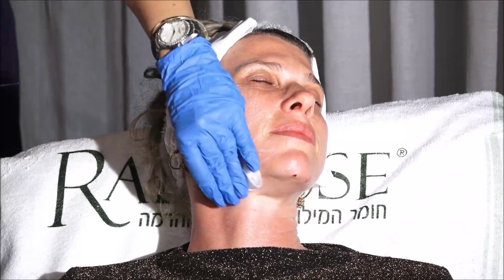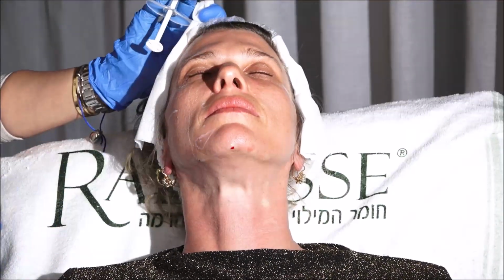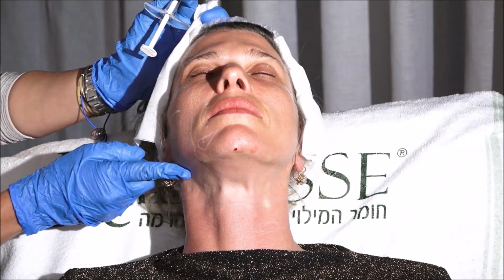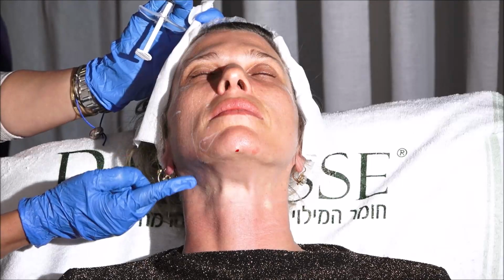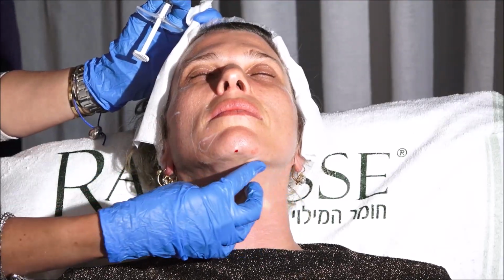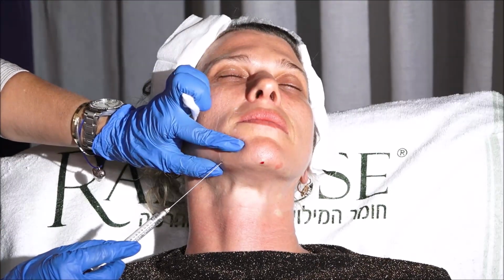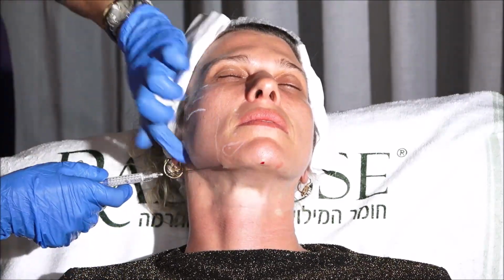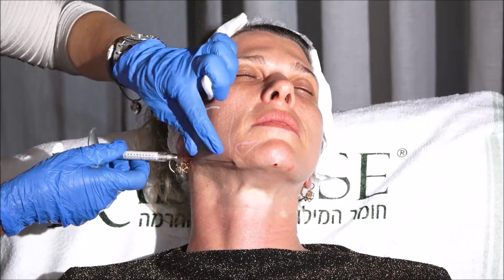I'm going to show you how it looks. If you see her neck, here is already more vertically augmented compared to this side. Great. No, don't need to. Stay as it is. For me, it's good.